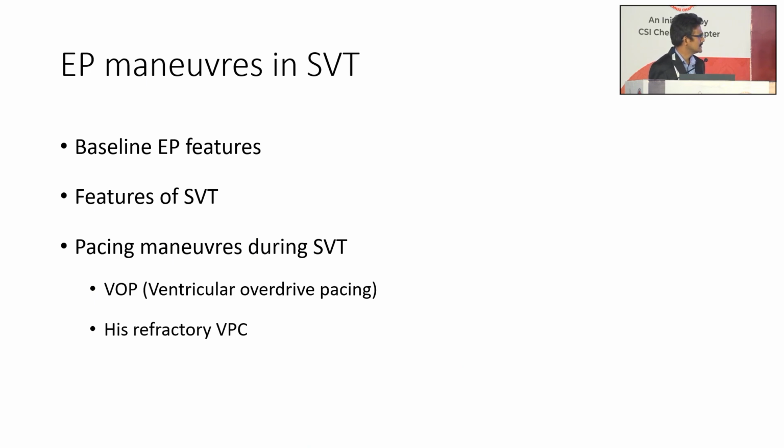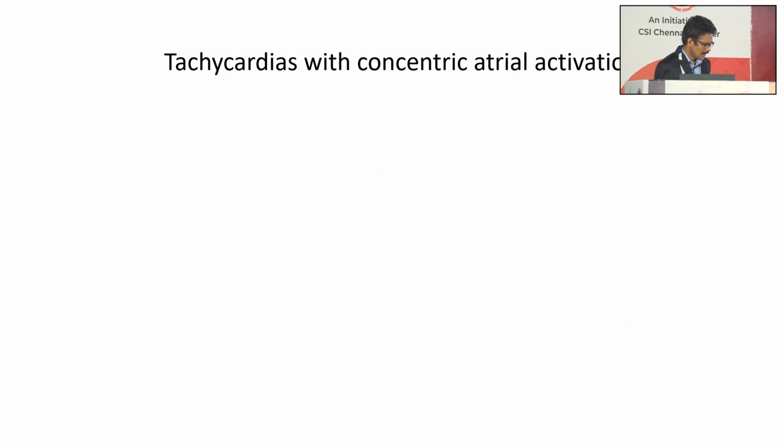Most commonly we use ventricular overdrive pacing and the His-refractory PVC. In my talk, I'll talk only about VOP. So the differential diagnosis is important, and comes into play.